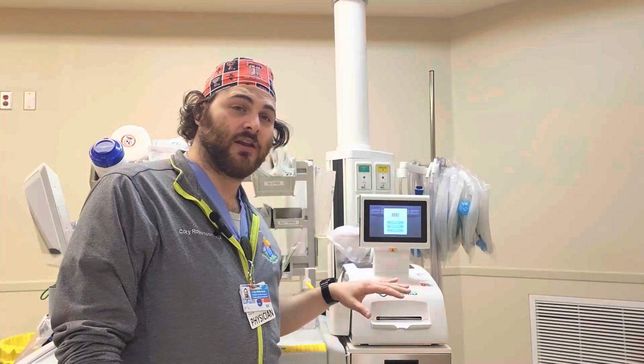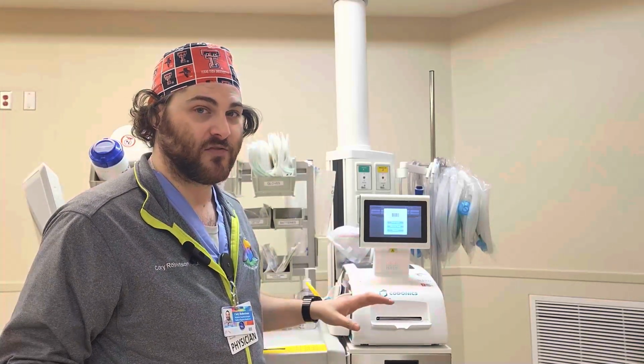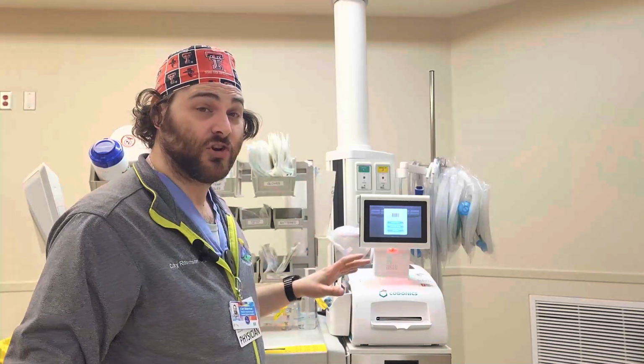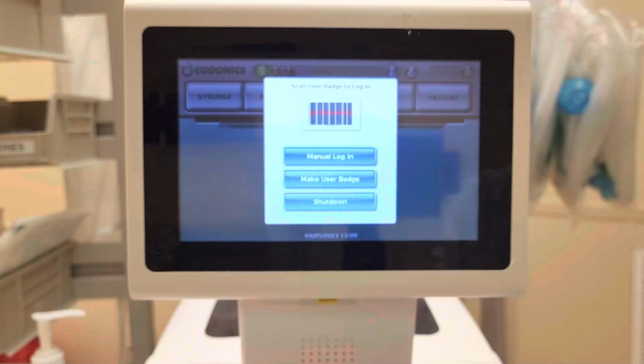So this is the Codonics SLS500i system. It's one of my favorite tools in the OR. I'm going to show you guys how to get through this, log in, and everything like that. All right, so let's get started with how to make a user badge.